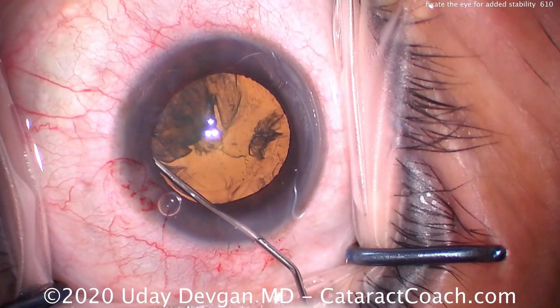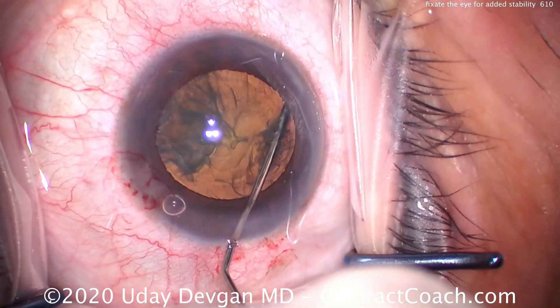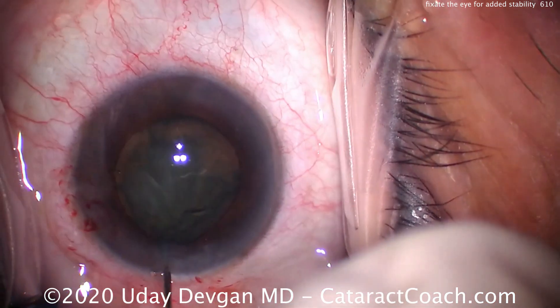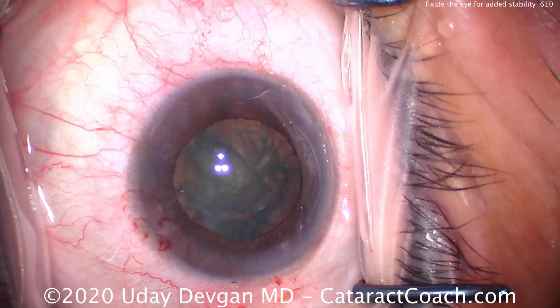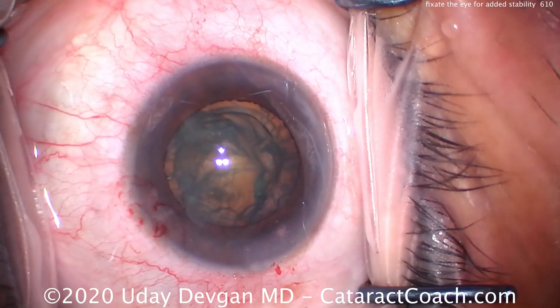Now, could you have done a different technique? Could you have just switched to a retrobulbar block or subtenon's anesthesia to help give akinesia of the globe? For sure, that would work too. But in this situation, we want the path that's least invasive, and for us that just means holding the eye with the chopper.